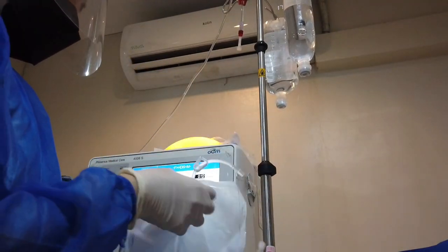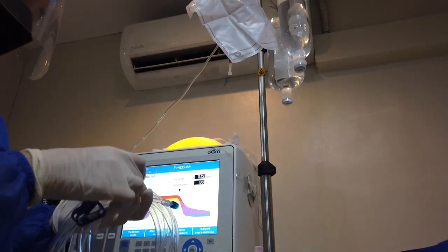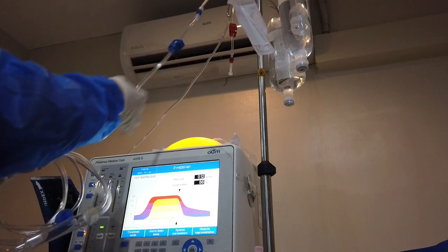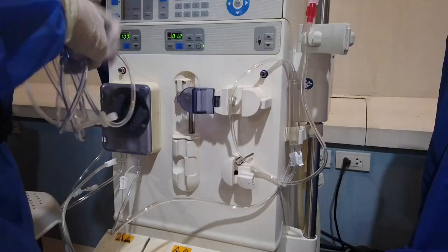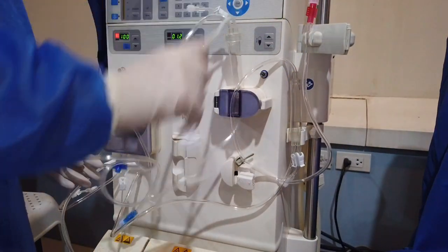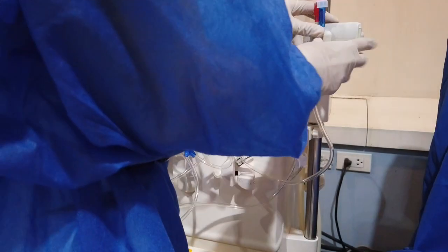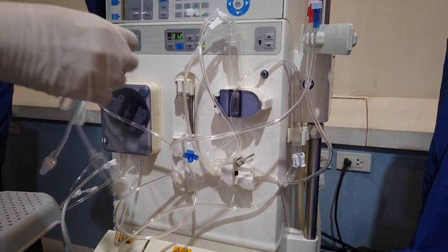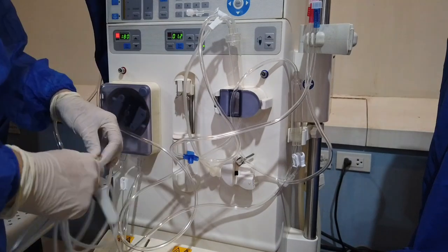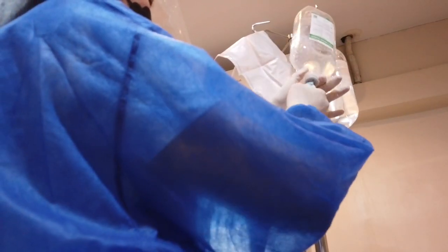For the venous line, let's start with the drainage bag by hanging it on the IV bag hook. Then attach the patient's end to it. Next, locate the venous chamber and place it loosely inside the venous chamber holder and close the surrounding clamps and attach the dialyzer end line on the dialyzer clamp holder. Connect the infusion end line to the saline port and spike the other end to the priming solution.